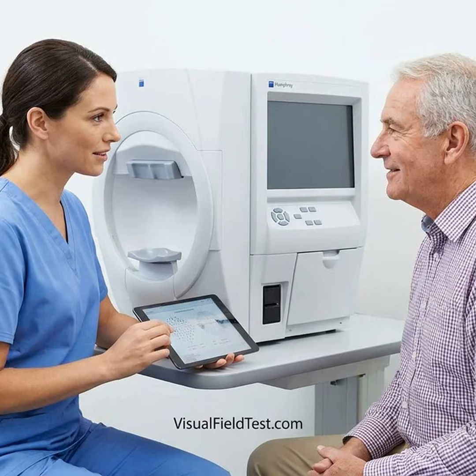After the test, ask whether the technician reviewed the reliability indicators. Ask whether the result is adequate for clinical interpretation. If the test is unreliable, ask whether a repeat test is needed and what could be changed next time. Do not assume that a darker grayscale area automatically means permanent worsening. The clinician must interpret the entire result and compare it with previous tests.